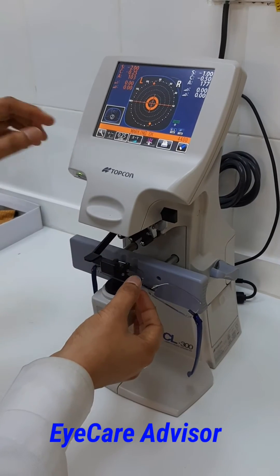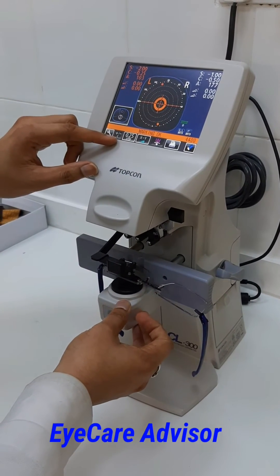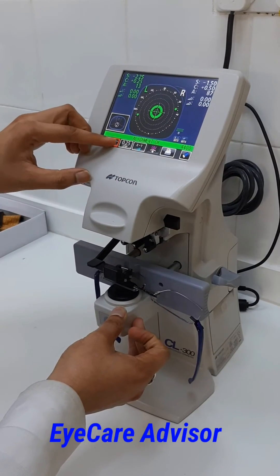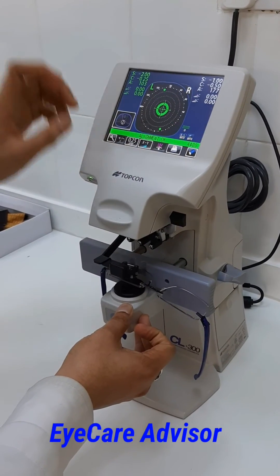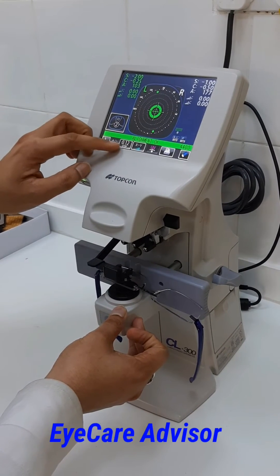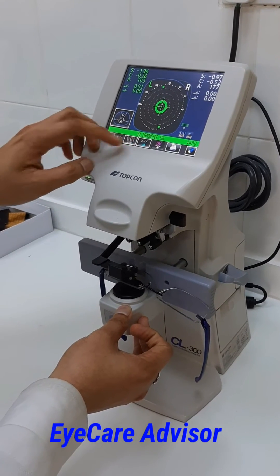It is as simple as that. If you want the reading in plus cylinder you can change it — you can see it comes in plus cylinder. If you want it in minus, you can switch to minus. These are 0.25 steps; if you want smaller steps at 0.12, that is also possible.